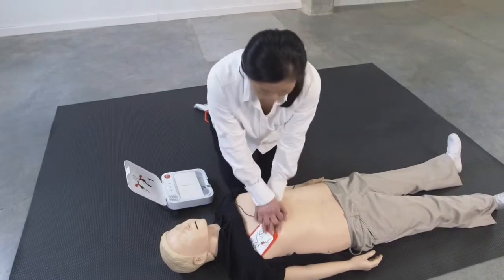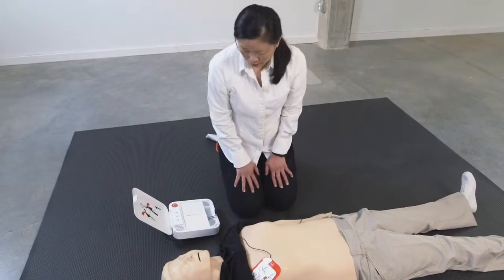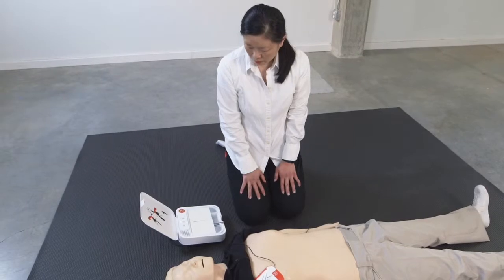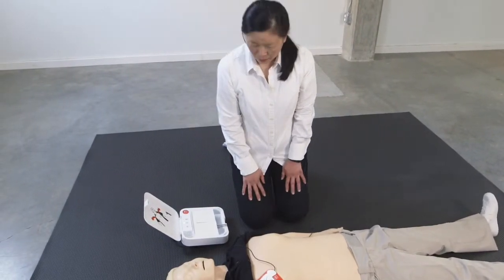Stop chest compressions. Everyone clear. Do not touch patient. Delivering shock. Shock delivered.